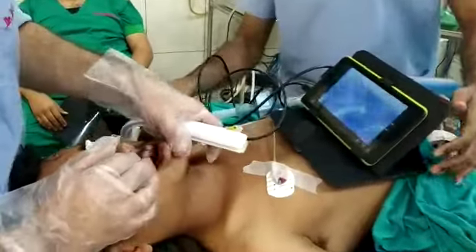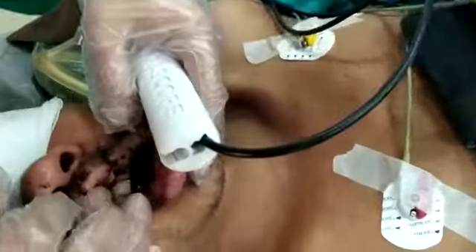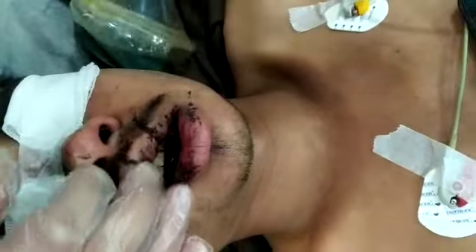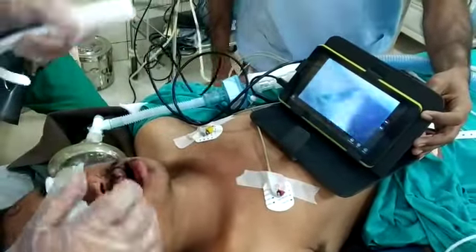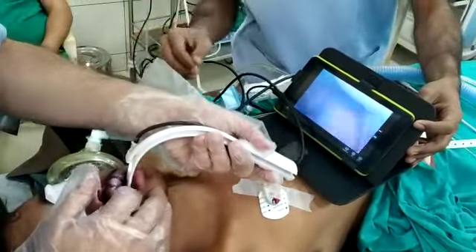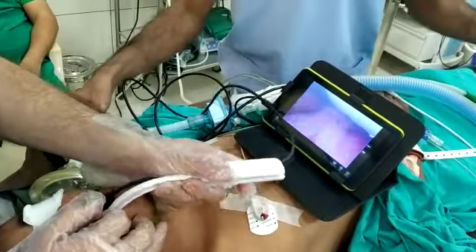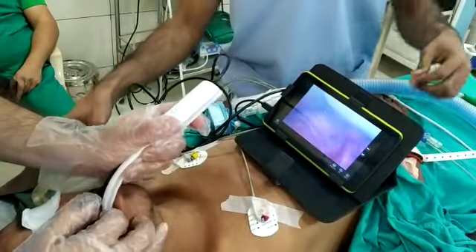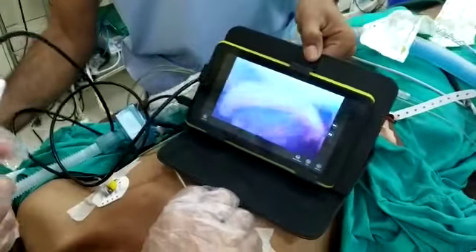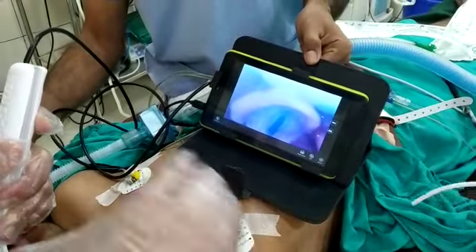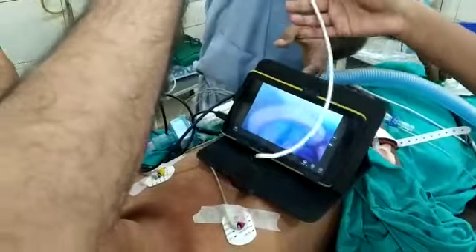We can see the mandible and the oral cavity, which is filled with blood. Now I am introducing the laryngoscope. Here we are able to see the epiglottis, and lifting up of the epiglottis, the vocal cords are seen.